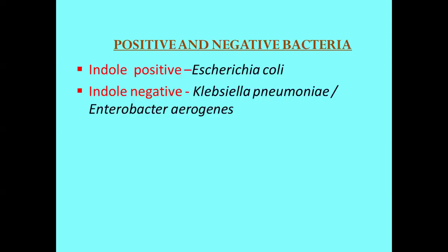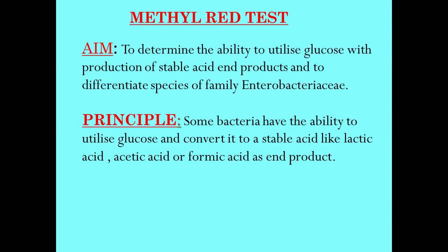So the indole positive organism is Escherichia coli, and indole negative are both Klebsiella pneumoniae and Enterobacter aerogenes. They won't give any positive reaction in the indole tryptophan agar medium, because those two organisms don't have the ability to secrete the enzyme tryptophanase.